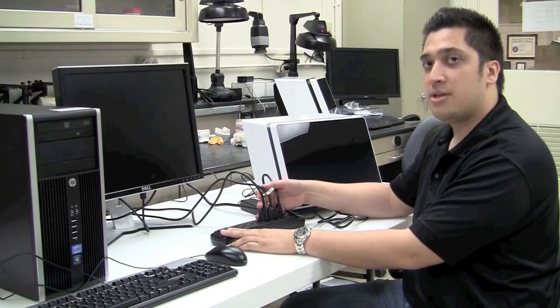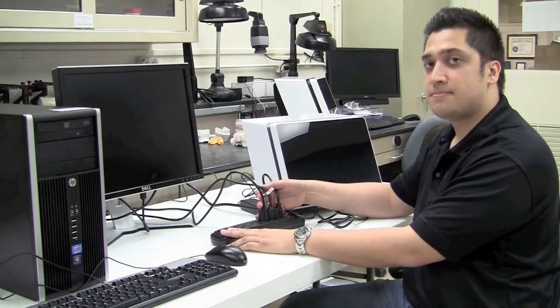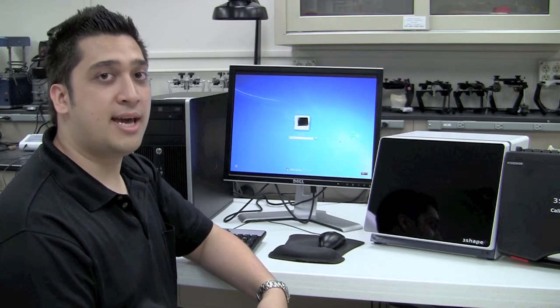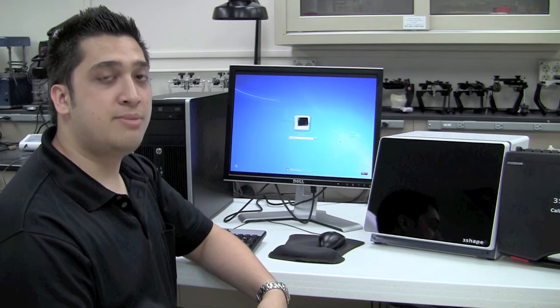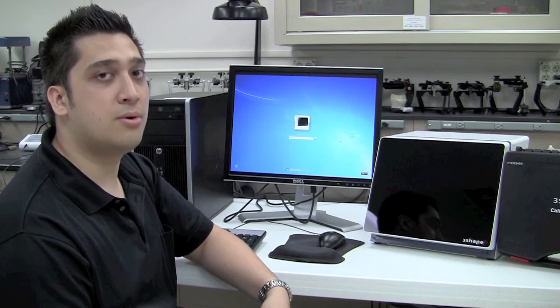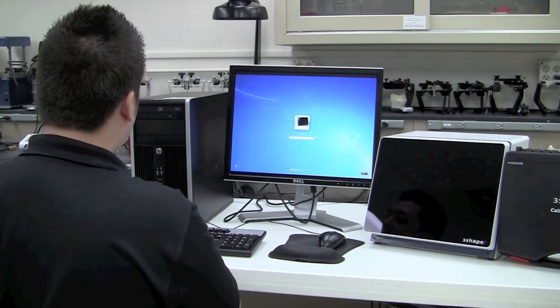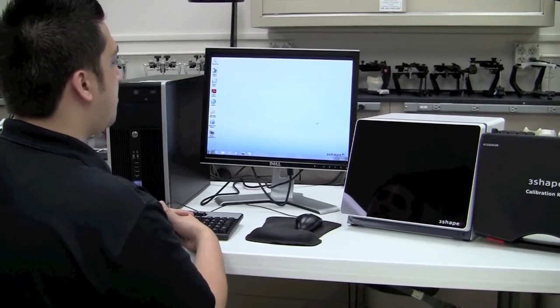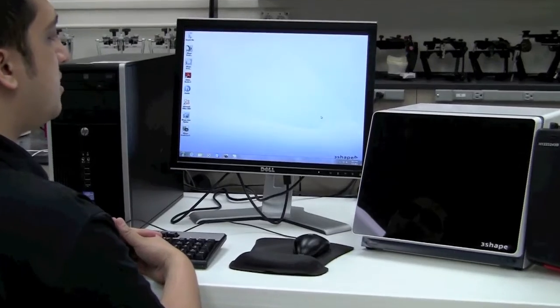Now that all data connections and power connections are hooked up between the computer, monitor, and 3Shape scanner, we're going to boot into Windows by turning on the computer and start our very first calibration. Once booted up, you'll see a Windows login screen. By default, your password should be the word 'scan' in all lowercase. If for some reason this is not the case, please consult the help documentation that came with your computer or scanner. Log in by typing 'scan' and give Windows a moment to boot up any background applications.